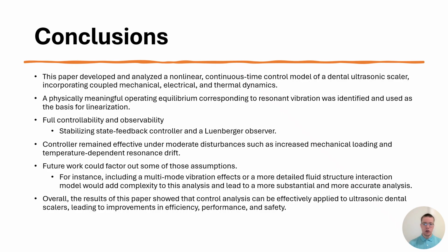As we saw, full controllability and observability was found, and a stabilizing state feedback controller and a Luenberger observer were derived. The controller remained effective under moderate disturbances such as increased mechanical loading and temperature-dependent resonance drift.